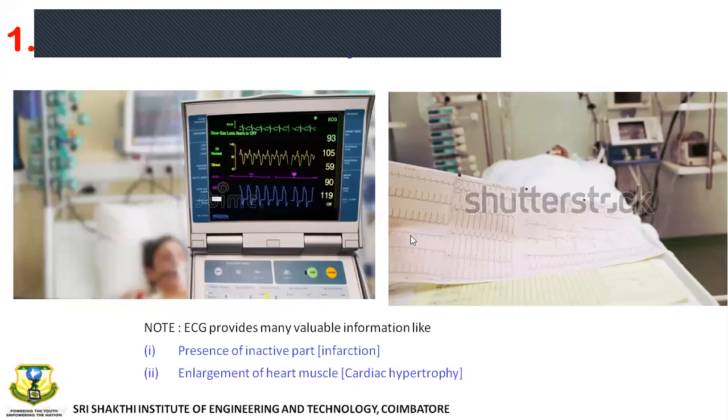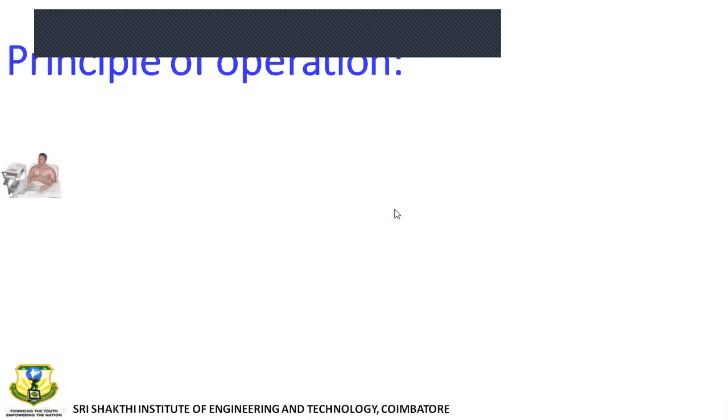So let's get into this electrocardiograph. The basic principle of the electrocardiograph is this one. There is a patient, right, whose electrocardiogram we need to obtain. From there, you can see that there are some wires being connected.